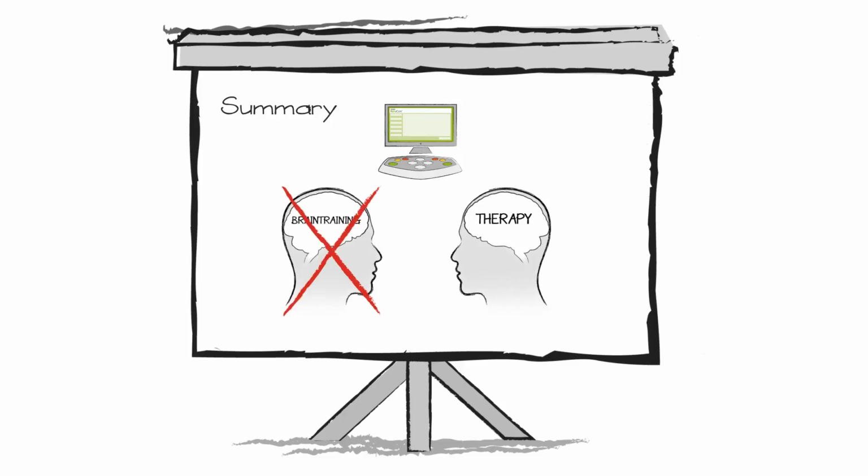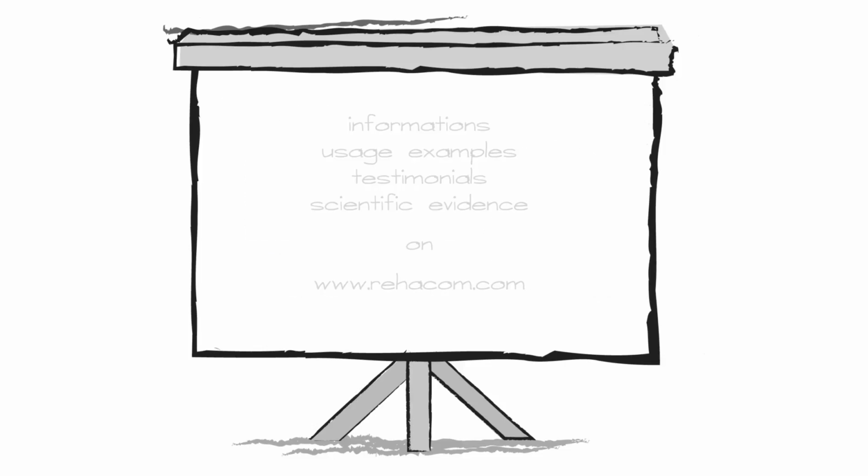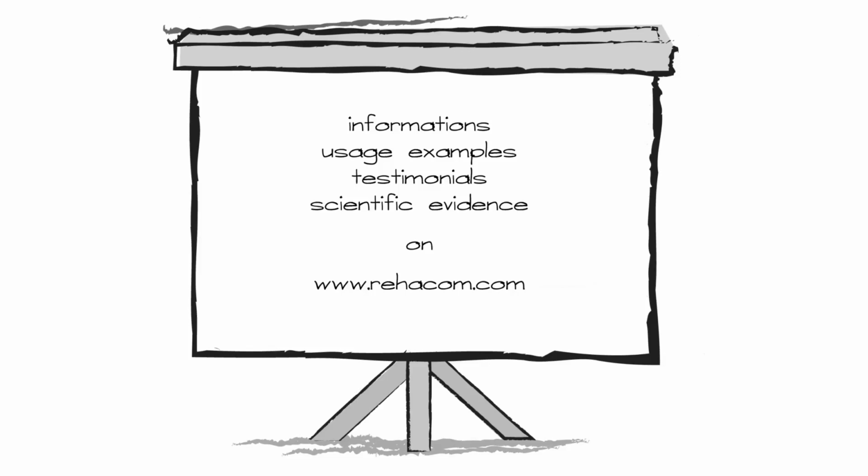RehaCom is much more than brain training. RehaCom is therapy. All information about RehaCom, usage examples, testimonials and scientific evidence can be found on the RehaCom website.